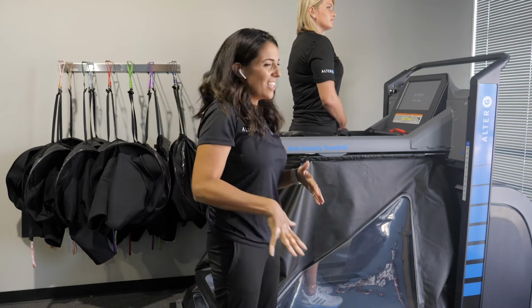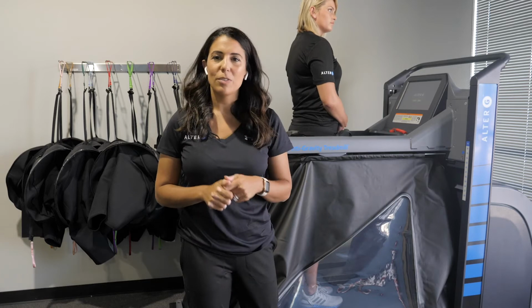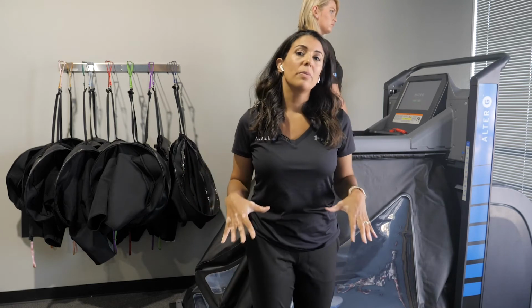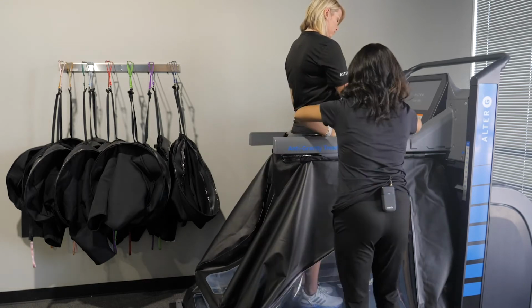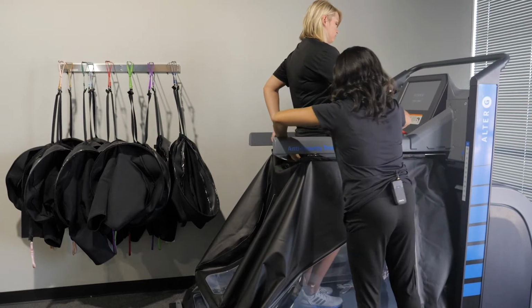You're just going to tuck in the skirt so it's inside of the bag, and then zip all the way around. We want to make sure that the zipper is completely to the end, just so it creates a complete airtight seal. So we'll go ahead and get Katie zipped in. Or at least tucked in.